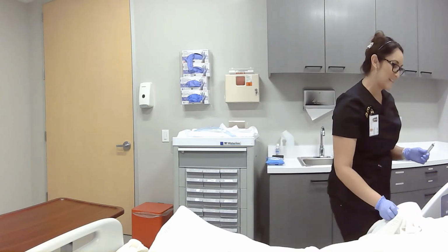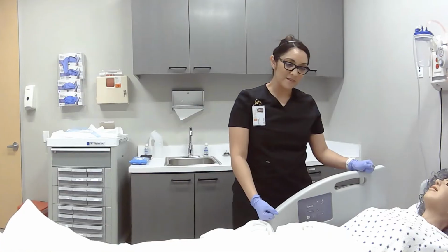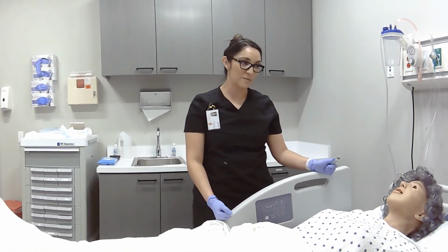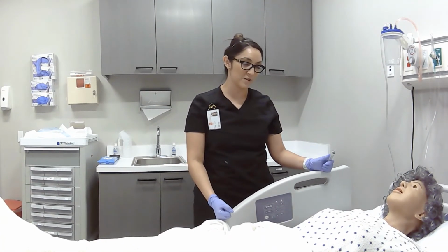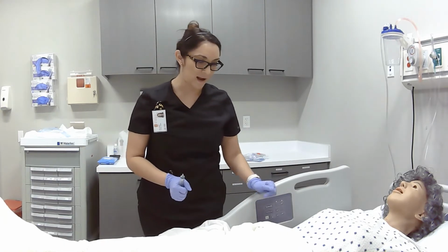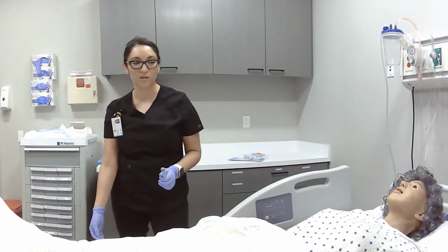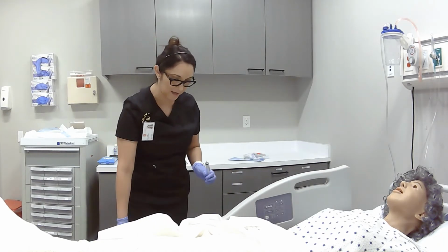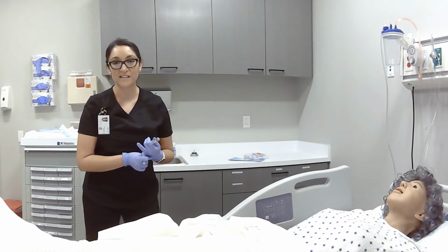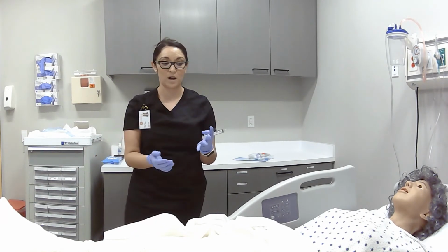Hi, Miss Adams, it's Cynthia again. Hi. So great news. Dr. Forbes has ordered for us to remove that Foley, okay? So in order to do that, I am going to clean you up. I'm going to empty the urine that's in your bag, in the Foley bag, okay? And I want to make sure that I document how much output, and also the COCA.